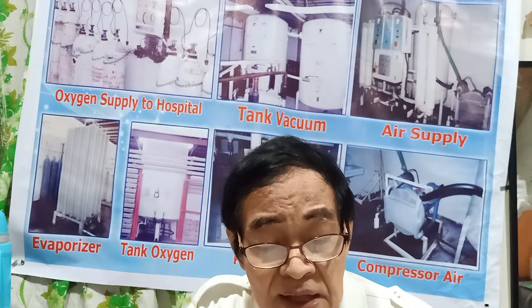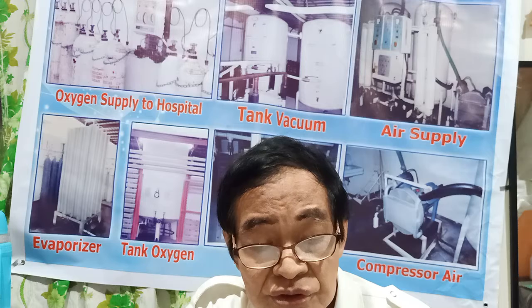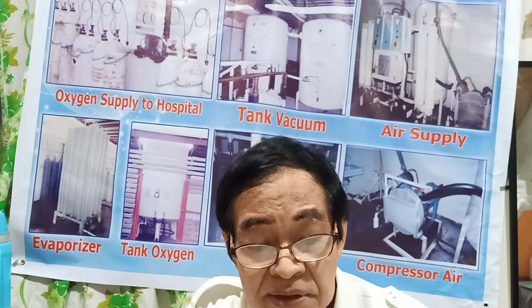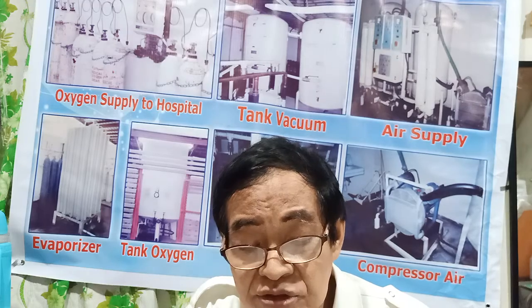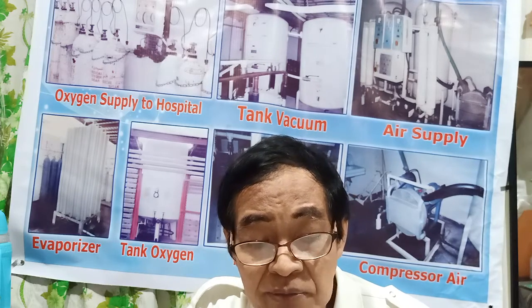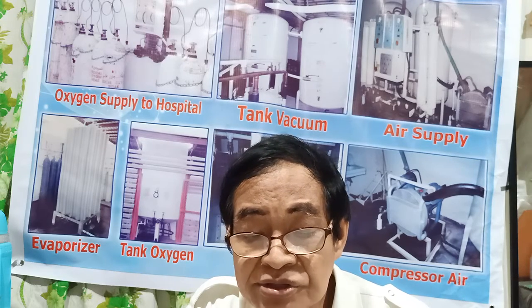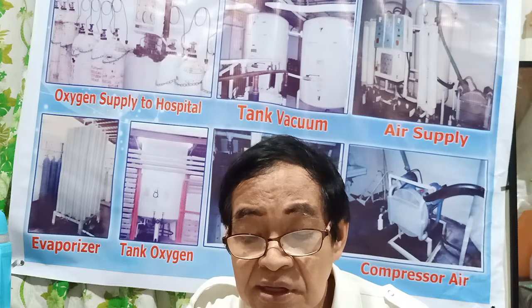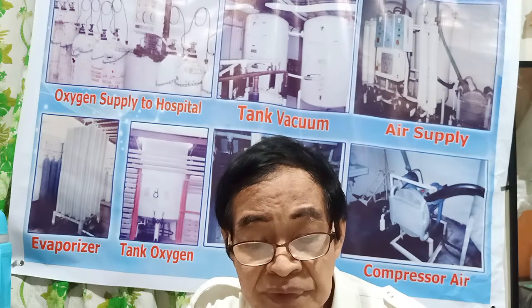It's okay. And next, if nitrogen, argon, and carbon dioxide are released in quantity into an enclosed space, the oxygen content of the air may drop radically, causing an acute risk of asphyxiation.